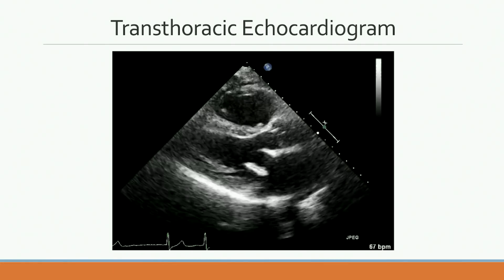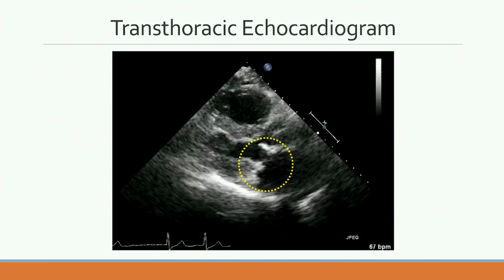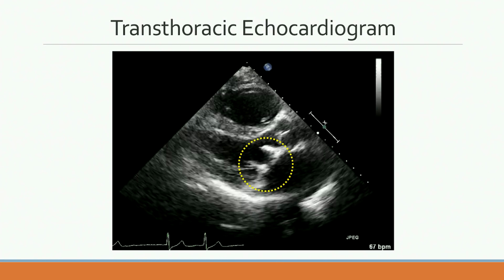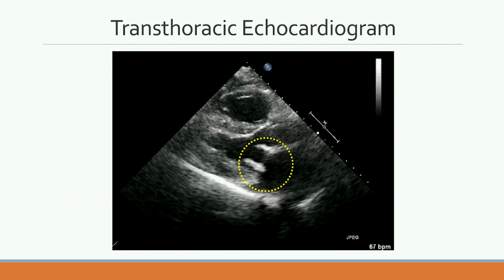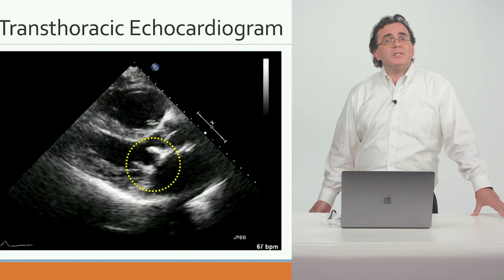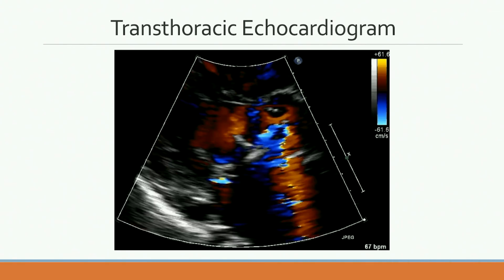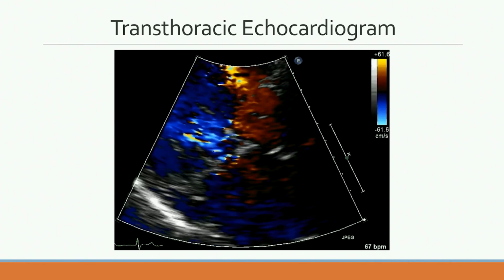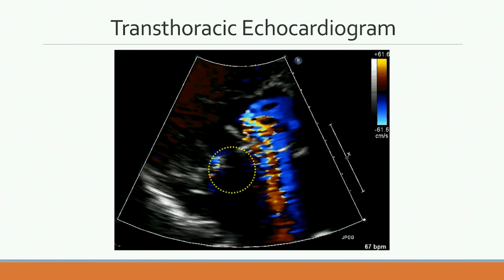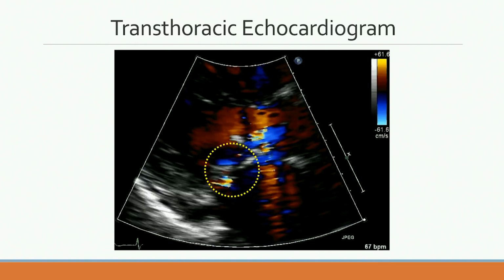So this shows you a parasternal long axis view in this patient, and in the middle of the image you see bioprosthetic mitral valve, which we already know that's a porcine Medtronic mosaic valve. The left ventricular systolic function is reasonably preserved, and we see that there is no rocking of the prosthesis. Now we will turn the color on to see if there is a significant mitral regurgitation. And actually you can see only a small degree of a color Doppler flow around the prosthesis, but doesn't seem very impressive. That would explain seemingly his dyspnea on exertion.